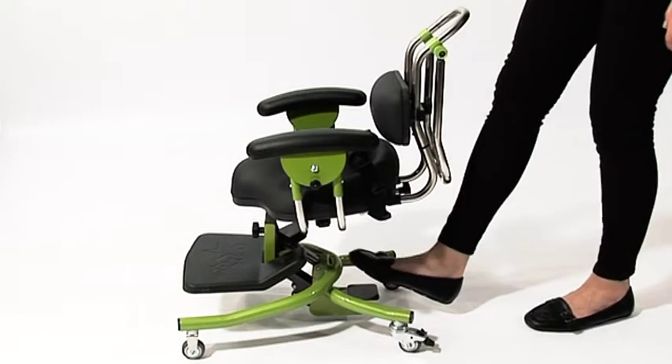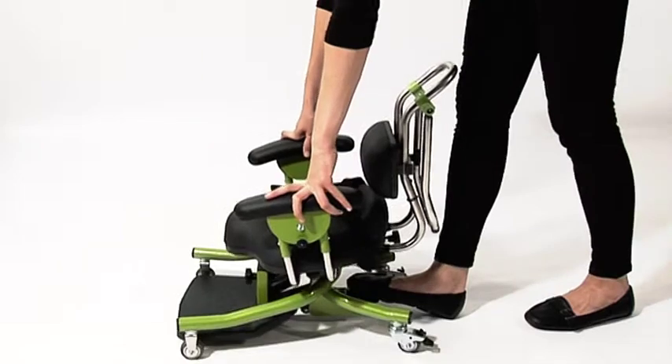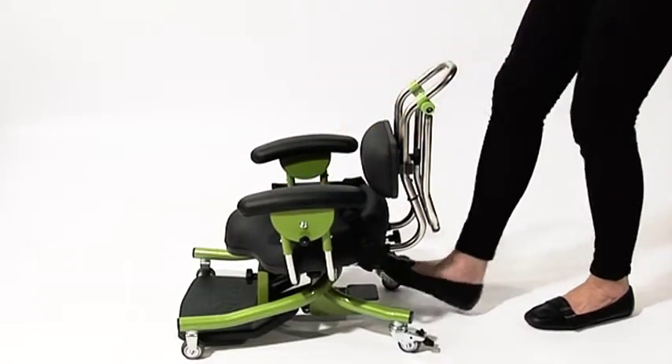To adjust the height of the seat, depress the pedal with your foot. Once the seat is at the desired level, take your foot off the pedal.